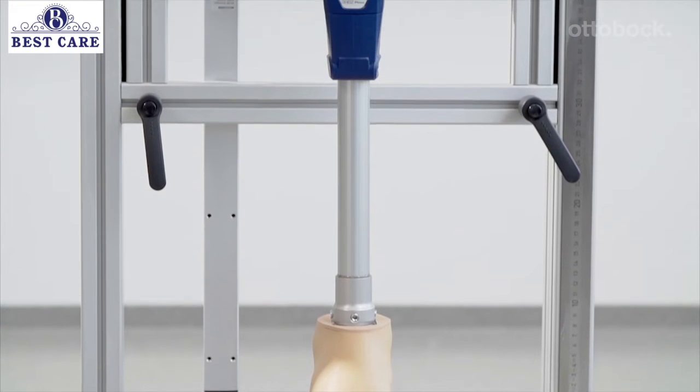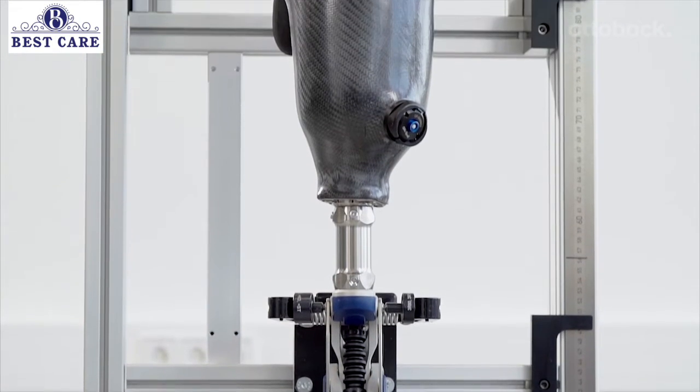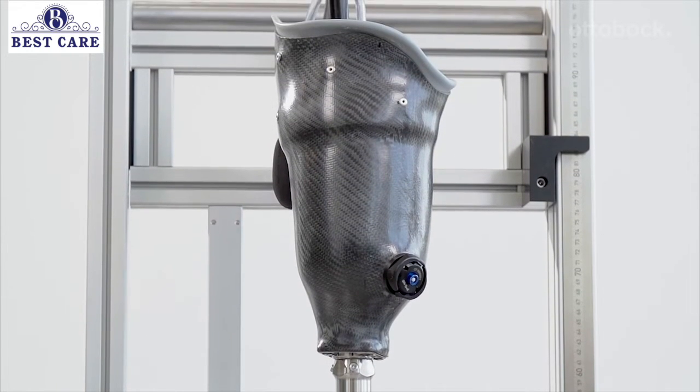The alignment and adjustments are easily completed in the following steps: bench alignment, static alignment, and dynamic fitting.